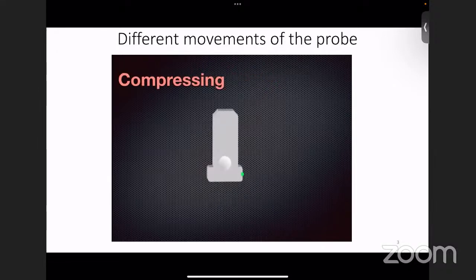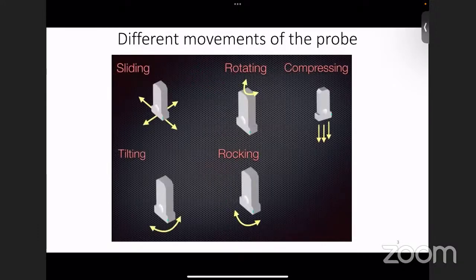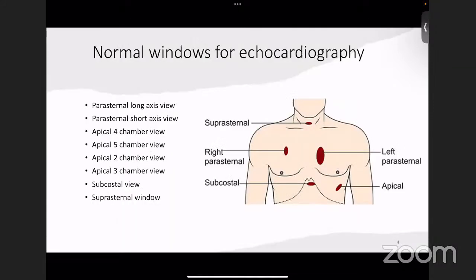And there is also compression, but this doesn't apply to our echocardiography. So these are the basic different movements of the probe.